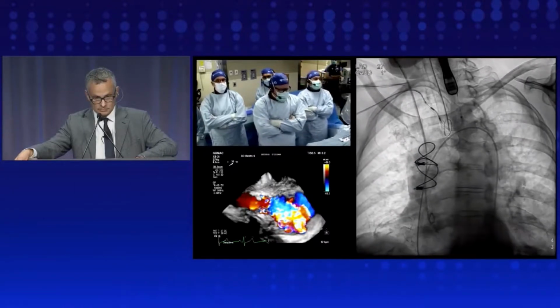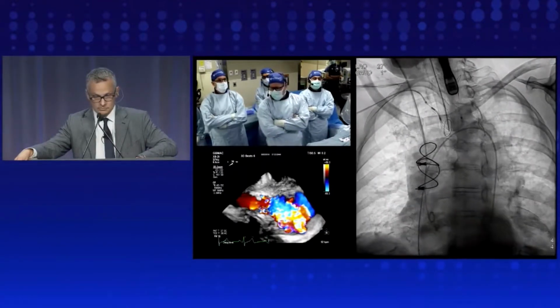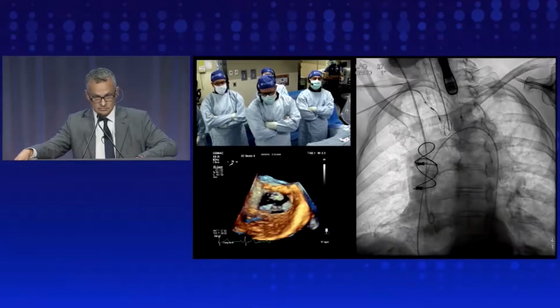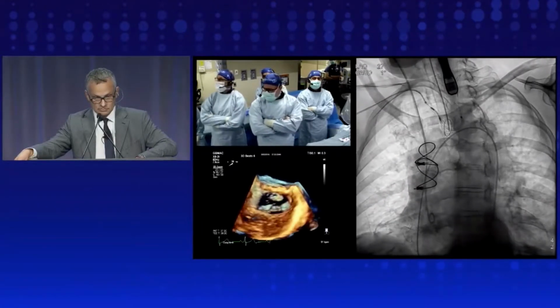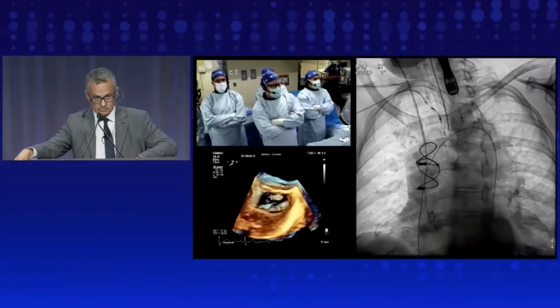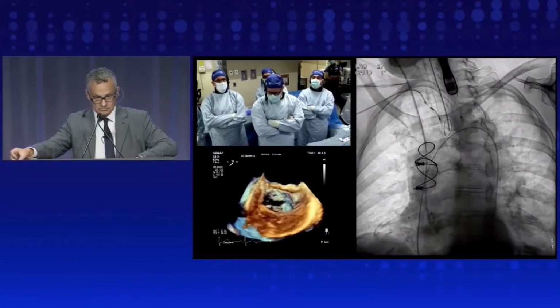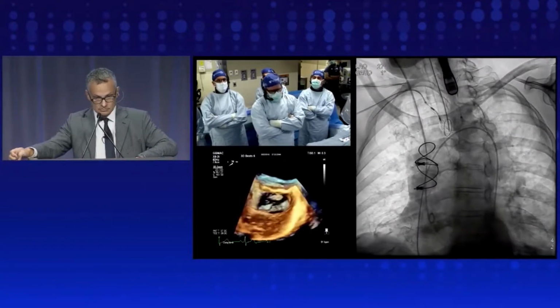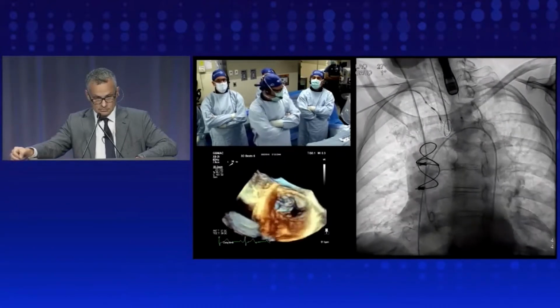And the safety profile of the device, as demonstrated in multiple trials, is very favorable. The only real downside at this moment is cost, which hopefully will be addressed, but we've decided that we think our patients benefit. If you believe the data, the meta-analysis would suggest almost a 50% reduction in hazard, and that seems good enough for us. So we have been using it pretty routinely.